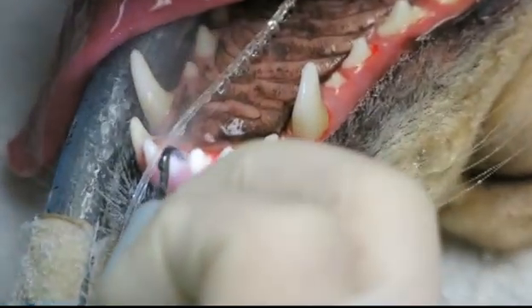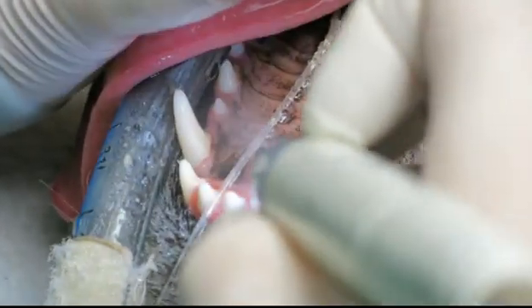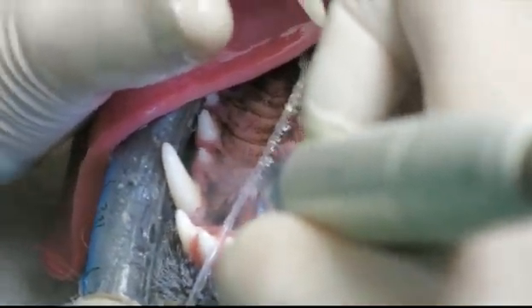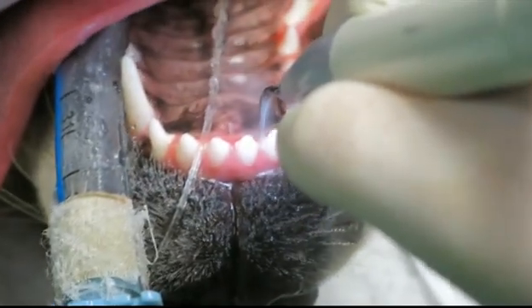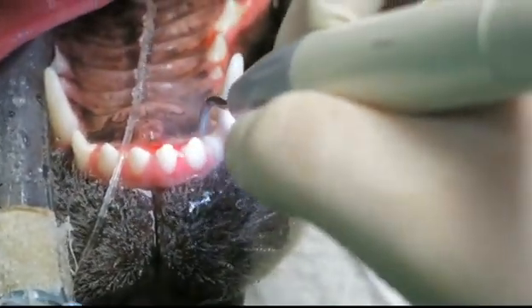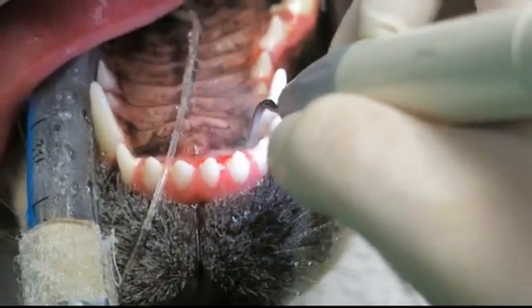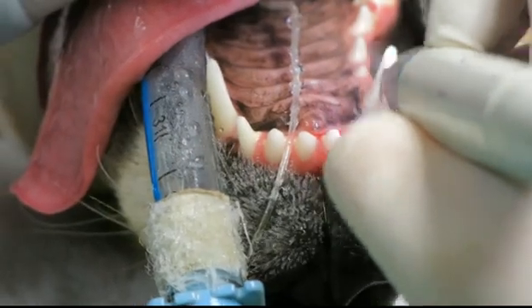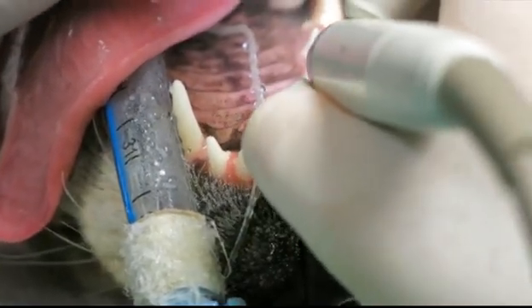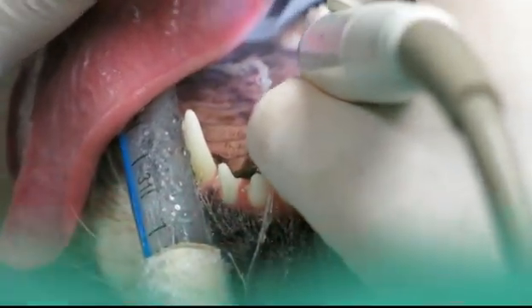There's a vibration at the tip of this ultrasonic scaler, and it gets very, very hot. So it's important for it to get cooled by the water. This is distilled water, so it's very clean — we don't use tap water.